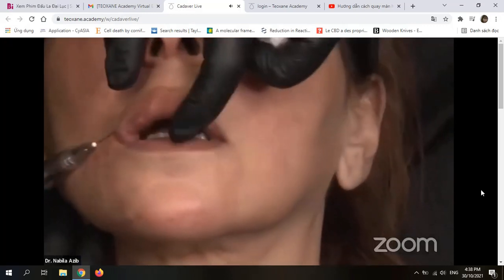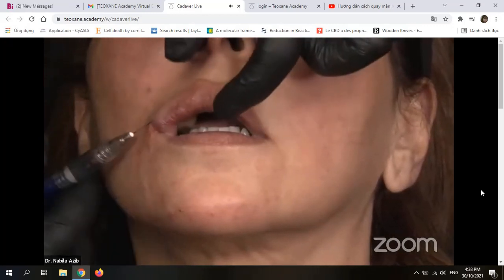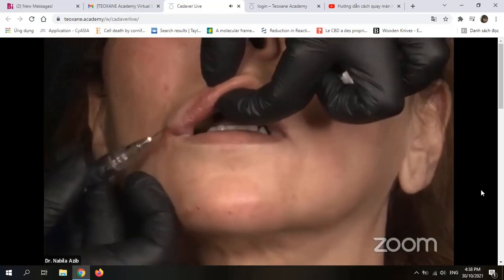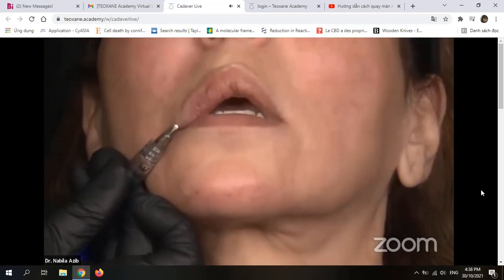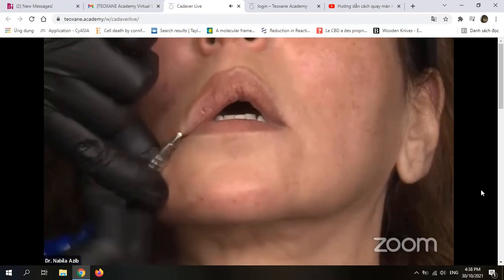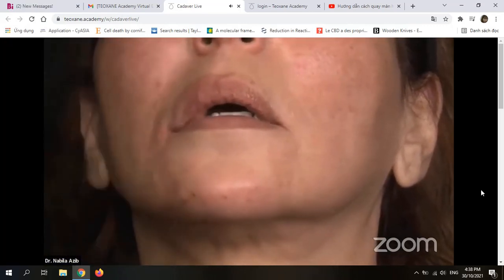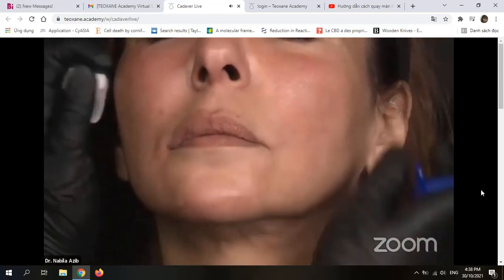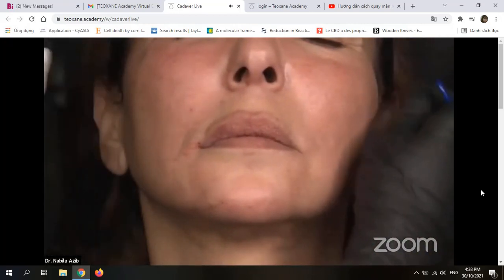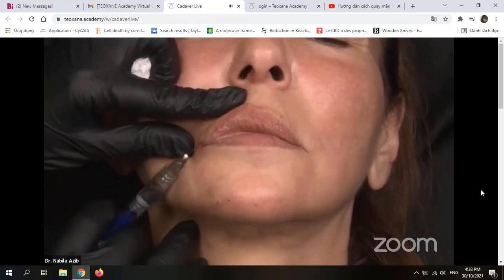So look, Ludmila, when I also want to contour the other branch of the V, I cross the midline, and because I'm on the good direction, I contour the other branch of the V like this, with a small retrograde, and that's it. Very nice. Yes, we can perfectly see the result.